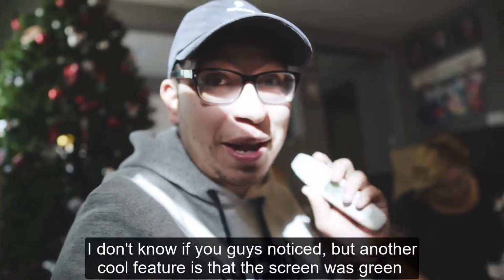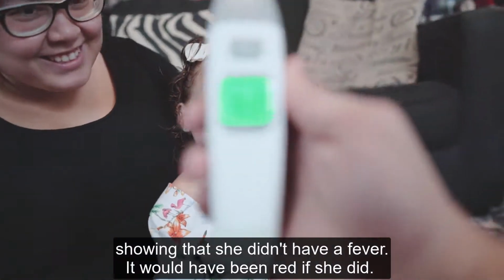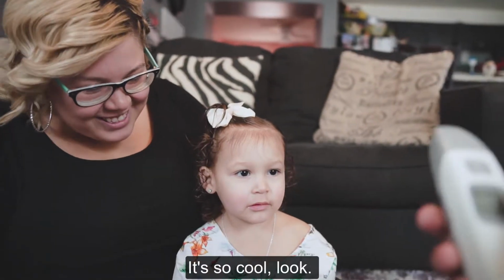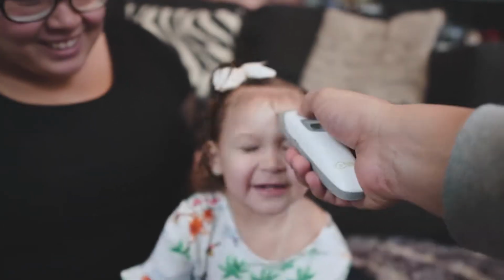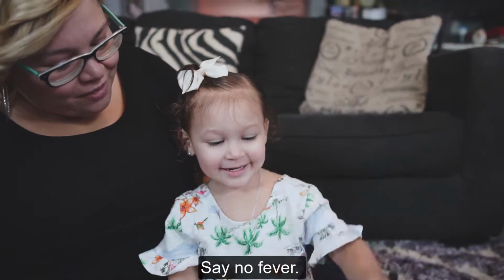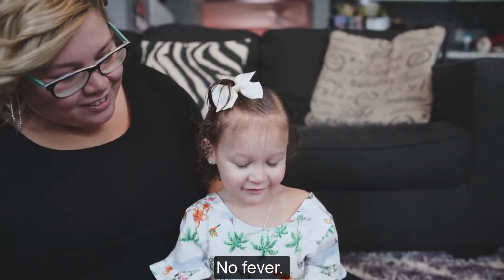Yay. I don't know if you guys noticed, but another cool feature is that the screen was green, showing that she didn't have a fever. It would have been red if she did. Do it again. It's so cool. Look. Yay. See? 97.1. Say no fever. No fever.